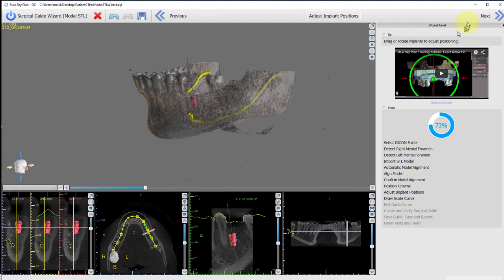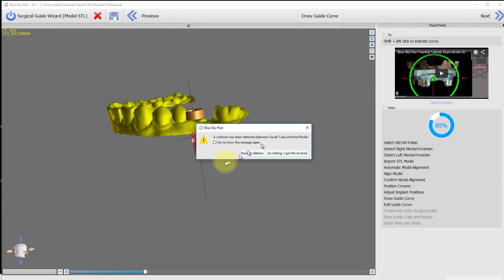We are in the wizard and have just completed the adjust implant position step. We will now click Next in order to draw the guide curve. A collision alert pops up allowing you to resolve the collisions automatically, or do nothing, which will then allow you to resolve the situation as you see fit. Click Resolve Collision.